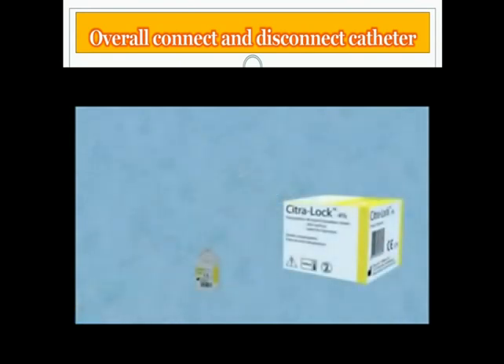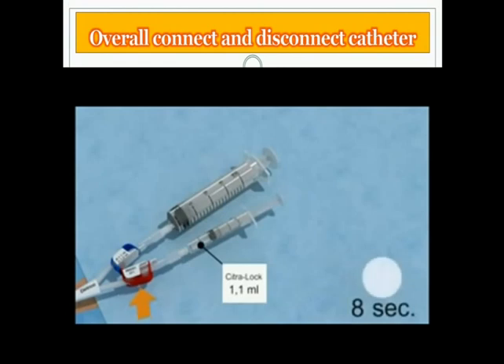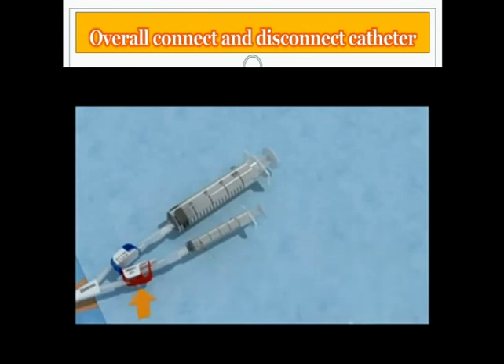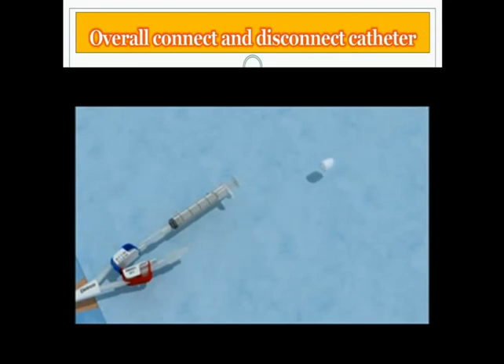Instill the CitroLock. Take the empty 2.5 milliliter syringes and fill them with the precise volume of CitroLock as indicated on the catheter. Remove the empty 20 milliliter syringe from the arterial port and place the syringe with CitroLock on the arterial port. Instill the CitroLock slowly in the arterial lumen. Repeat the same procedure for the venous lumen. Remove the syringes and close the lumens with sterile caps.